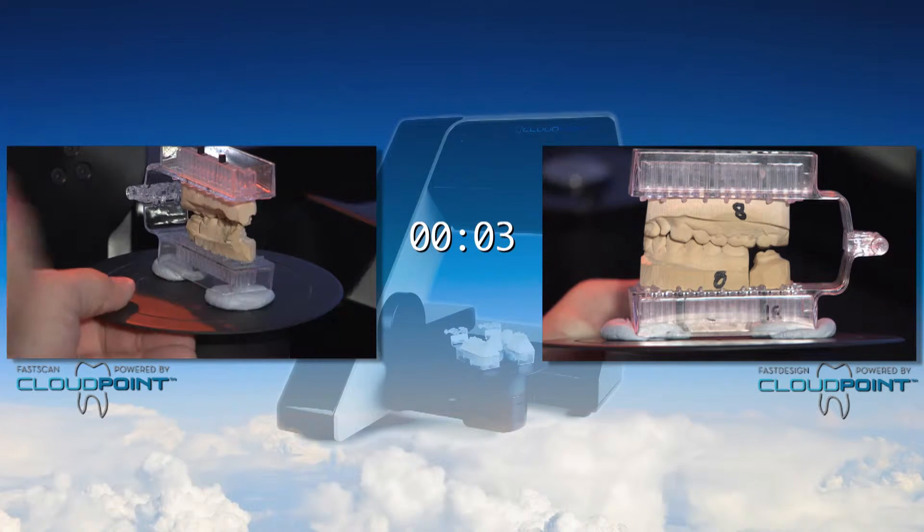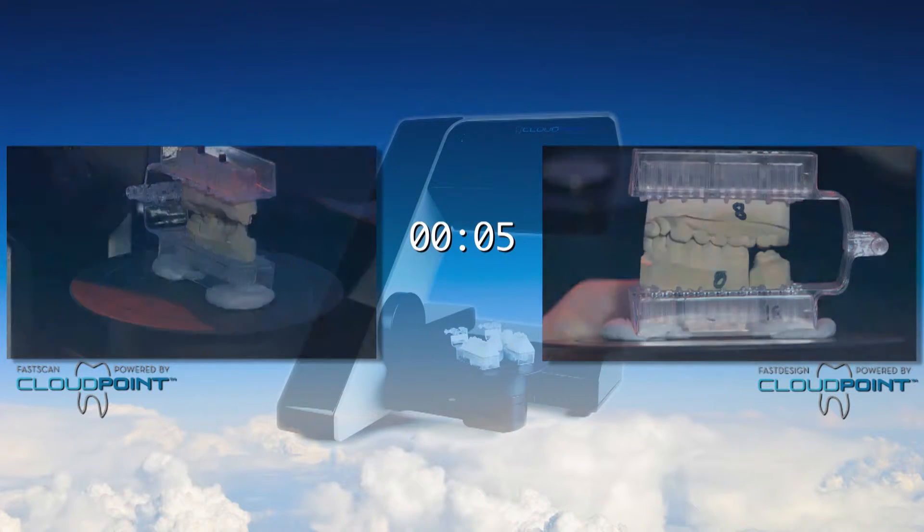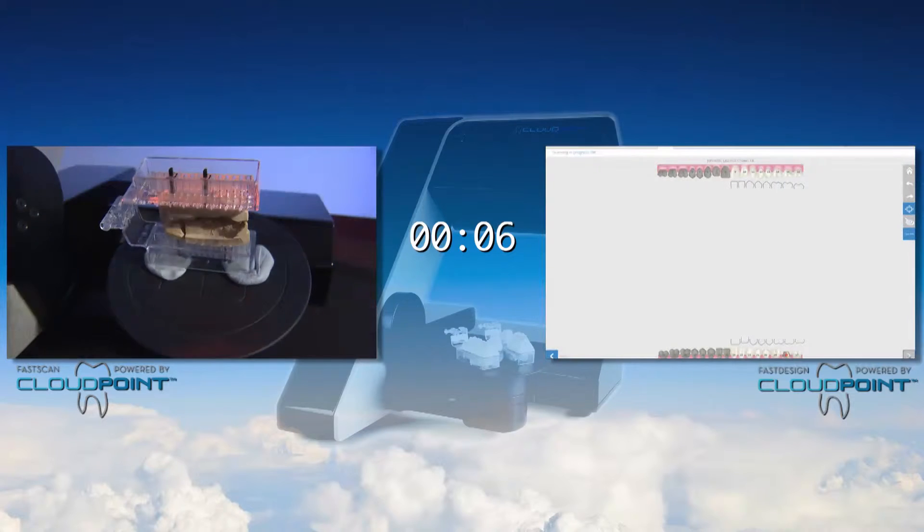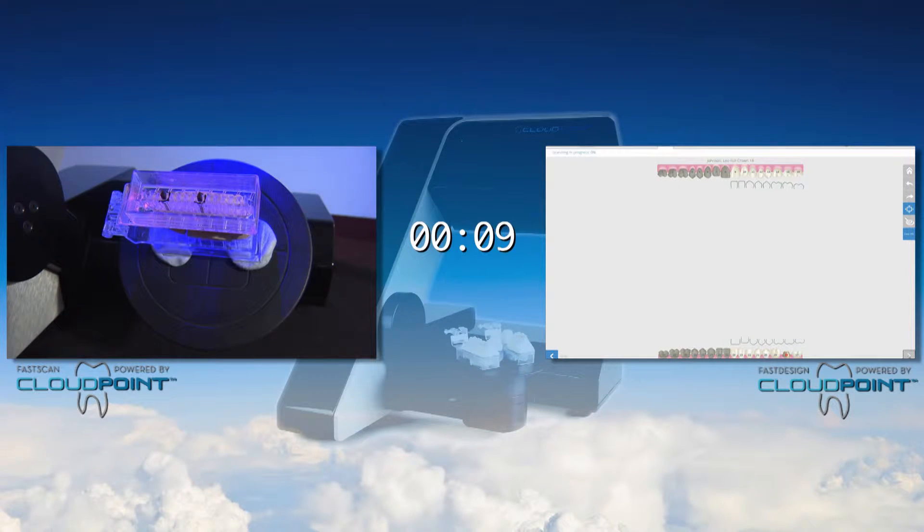Using the CloudPoint scanner is easy and quick. First we set up the articulated case and scan the buccal bite.